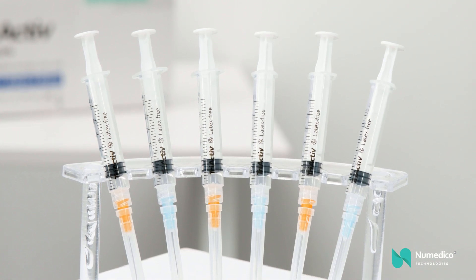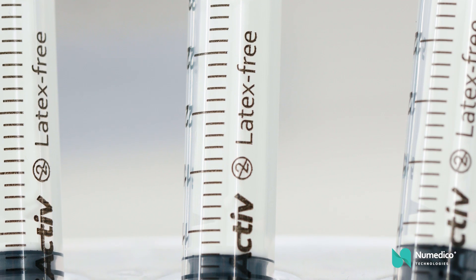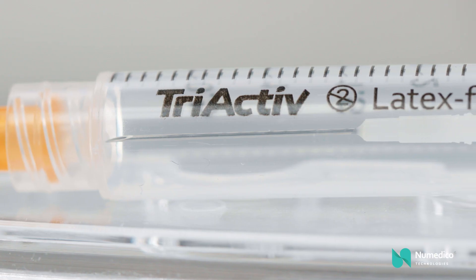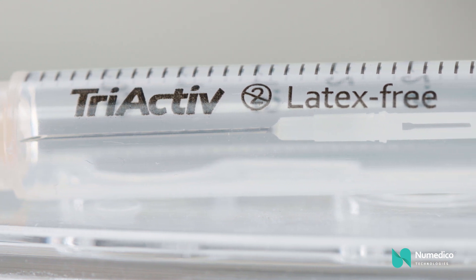The Tri-Active Needle Retractable Safety Syringe is a high quality, globally patented Swiss technology needle with a simple to use retraction mechanism to prevent needle reuse and needle stick injury worldwide.